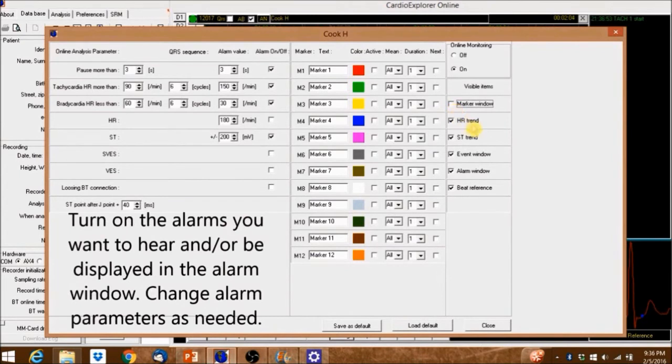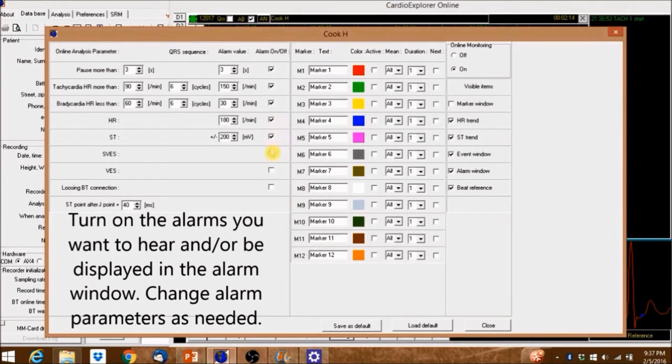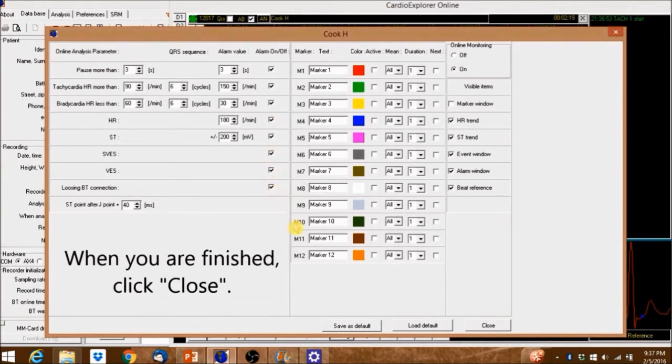Turn on the alarms you want to hear and or be displayed in the alarm window. Change alarm parameters as needed. When you're finished, click Close.